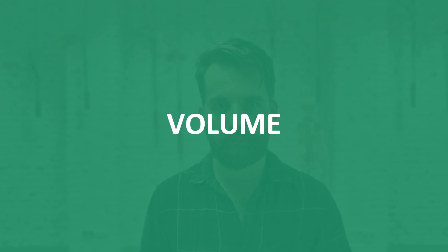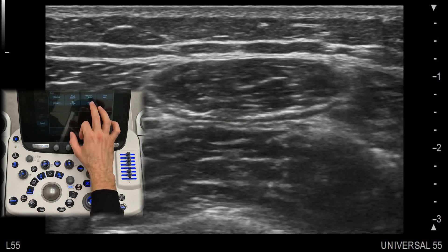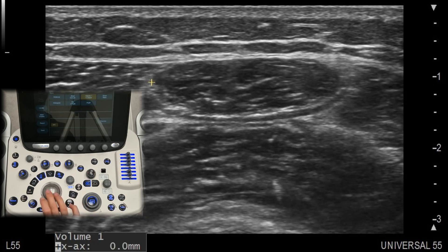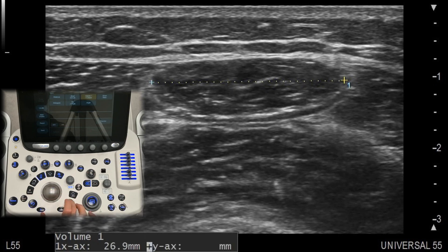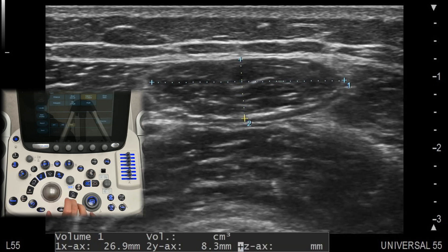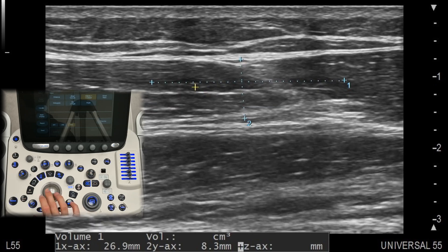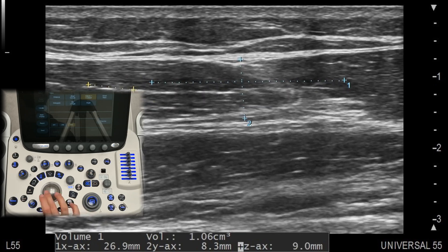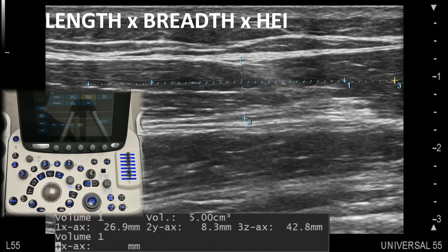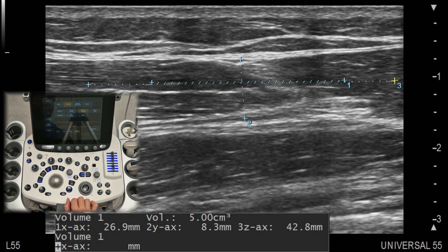For volume measurements, some machines allow you to combine multiple distance measurements to calculate the volume of a structure such as cysts or fluid collections. This can be especially useful for larger or more complex masses. If your machine doesn't calculate volume automatically, you can use a manual calculation based on the shape of the structure. The generic formula is: length × breadth × height × 0.523, which assumes that most structures are ellipsoid.